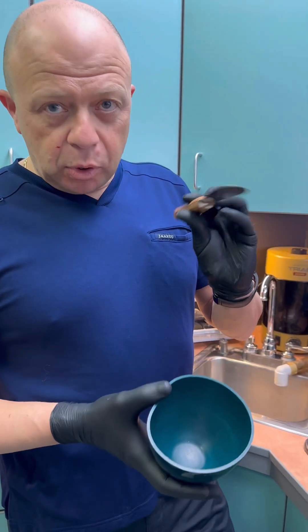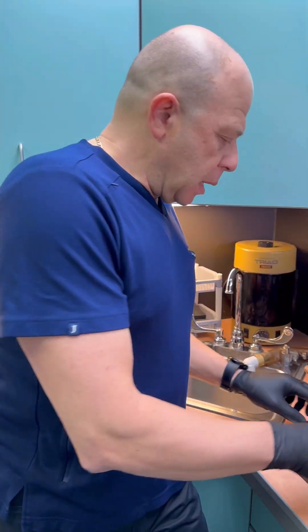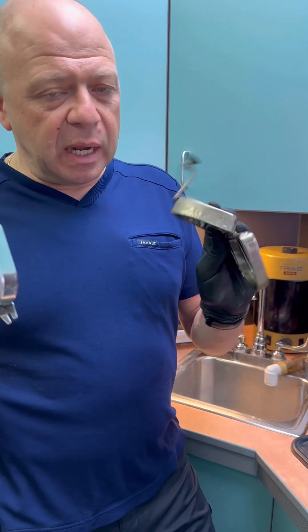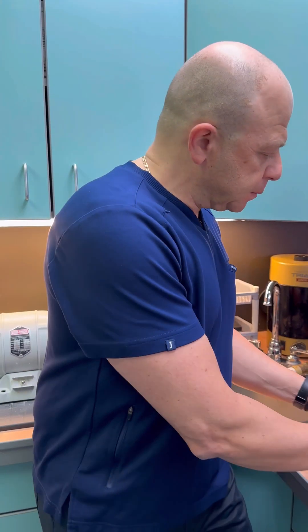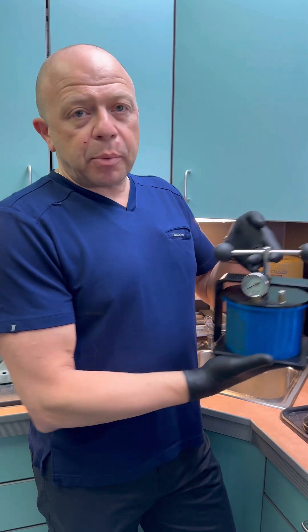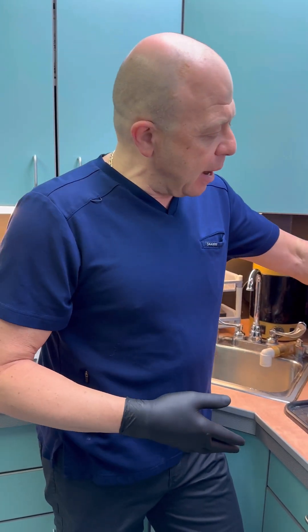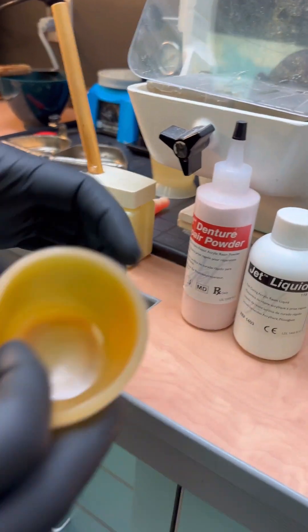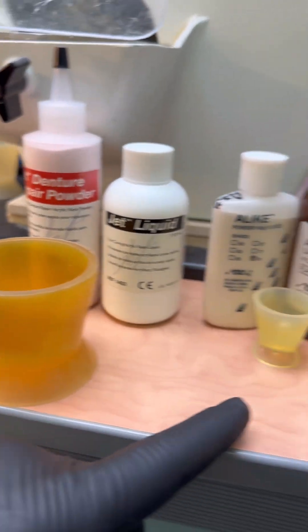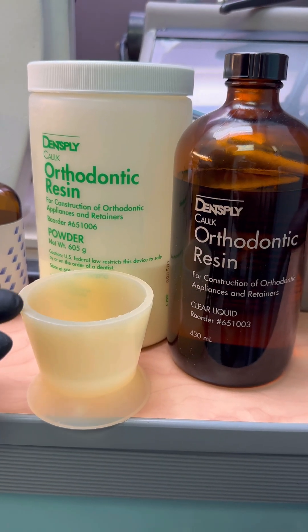What do we need? We need an alginate bone spatula. We need a sharp laboratory knife. We need our denture duplicating flask — they come in a couple of sizes, there's the small one and this is a larger one. We need a pressure cooker — this is a water activated one, and there's one that is activated on air. Vaseline. Repair acrylic with a proper bowl. Tooth colored acrylic with a proper bowl. And orthodontic resin, again with a proper bowl.